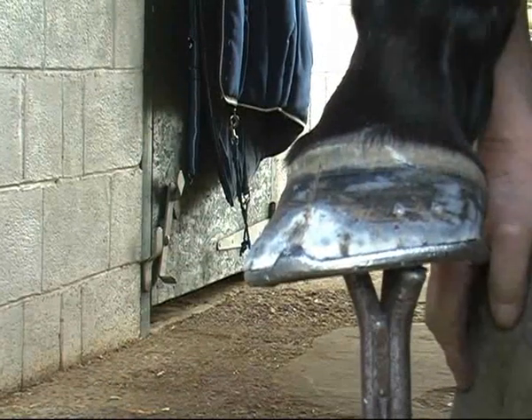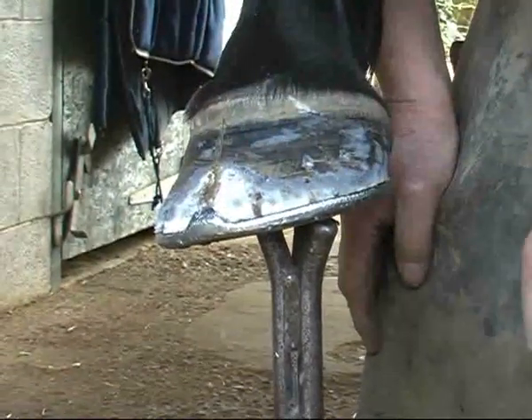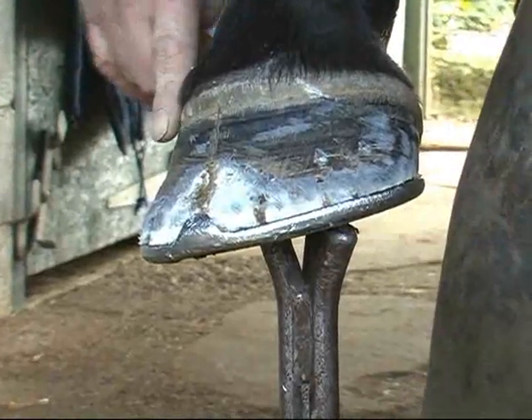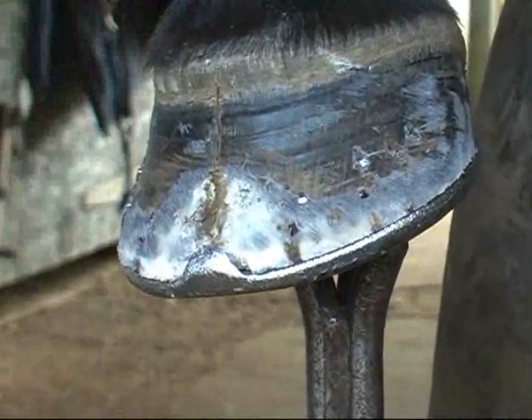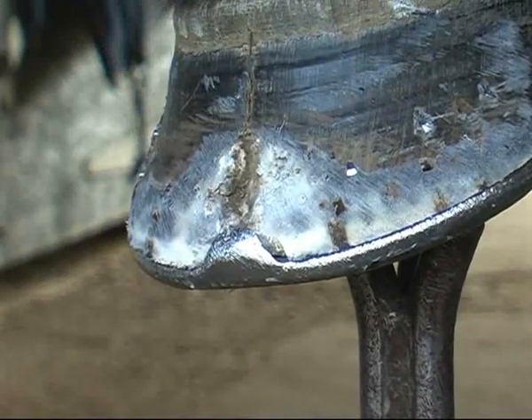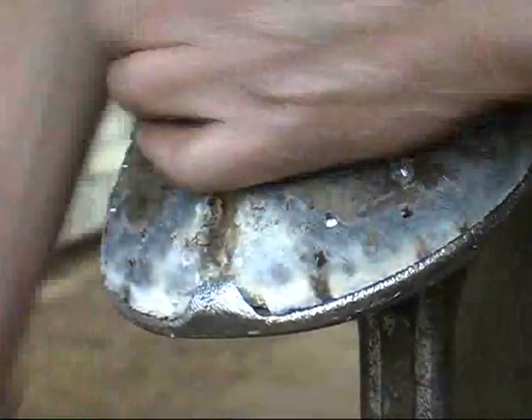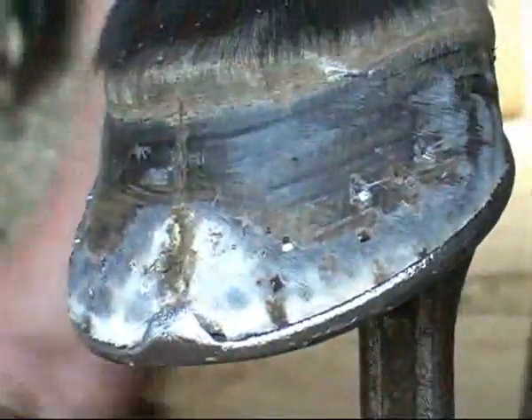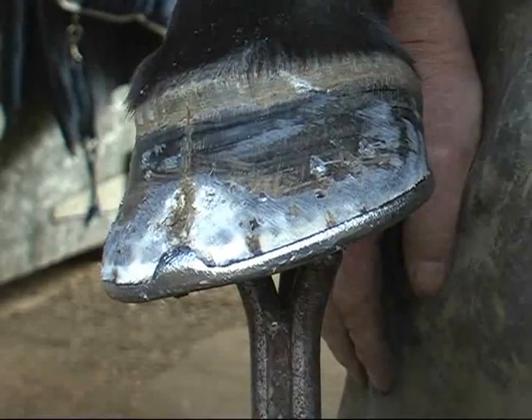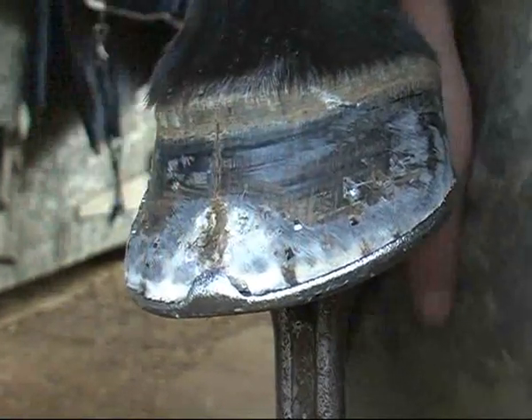Here we have the control sample foot. You can see the extent of the crack that we covered over with the first patch, the holes and the fine crack that goes up from it. I've dressed the flares off of it. It still has a slight dorsal depression here and it still isn't stable. I'm pretty certain — I'm going to stand this horse on the floor now — if you watch that crack, I think it will demonstrate when it's loaded and unloaded that it's still opening and shutting. To be fair to this horse, I think we now need to take this foot out of the control state and put a band like the other one on it. On day one this was a far less traumatised foot than the other one, clearly indicated by the total absence of a white zone showing near the border of the shoe.